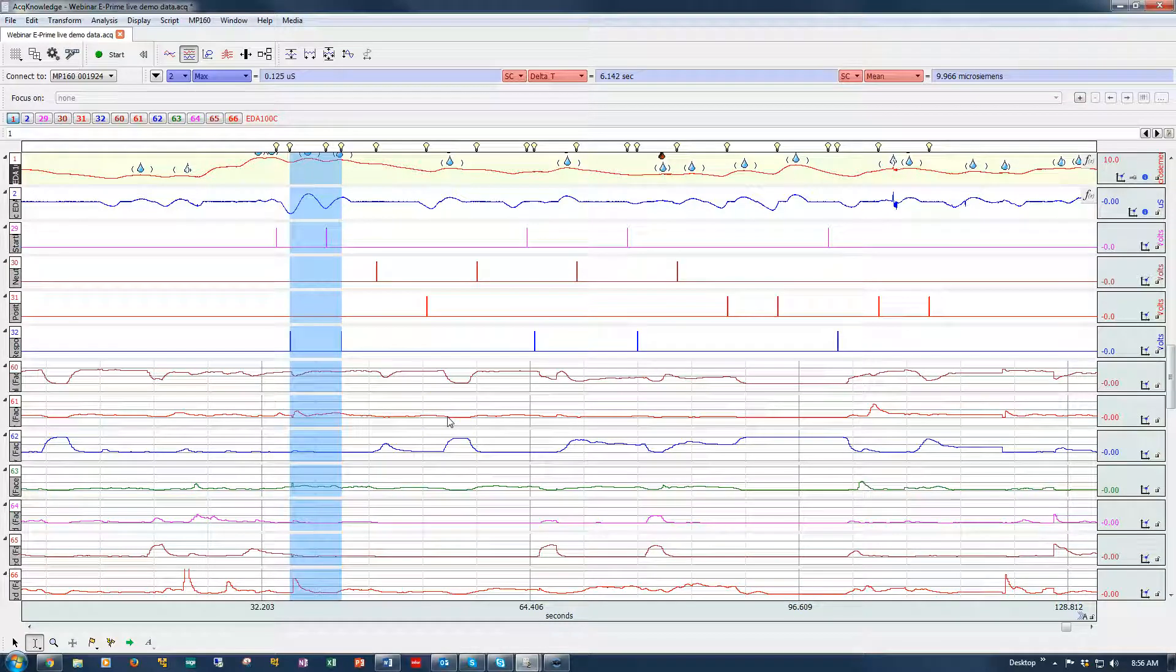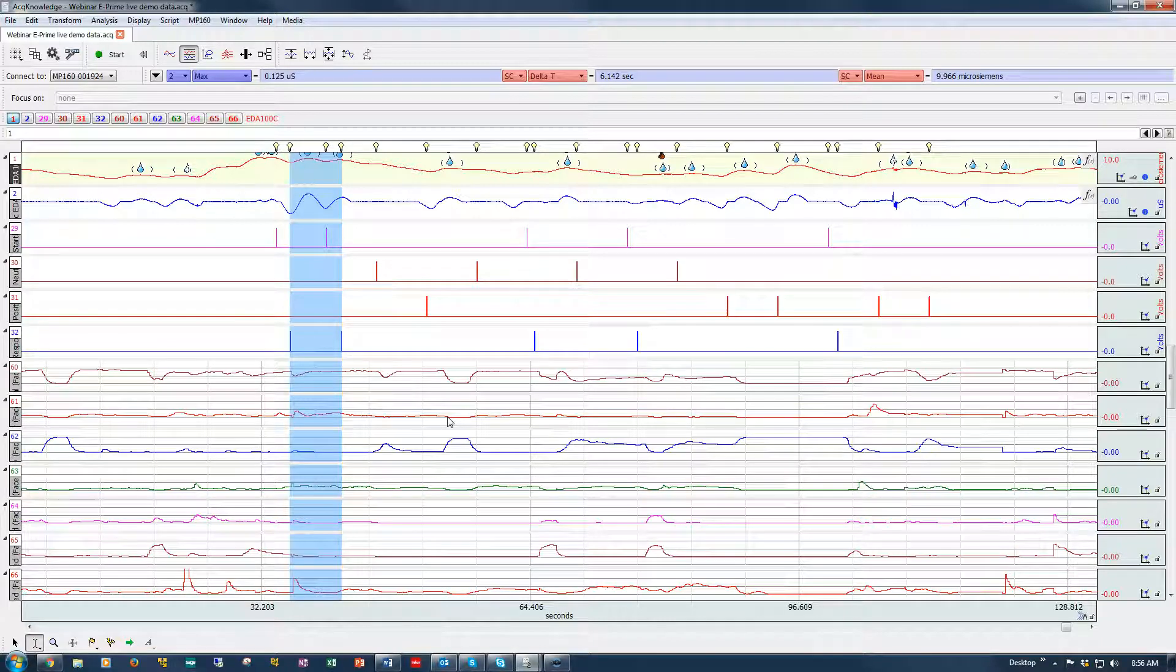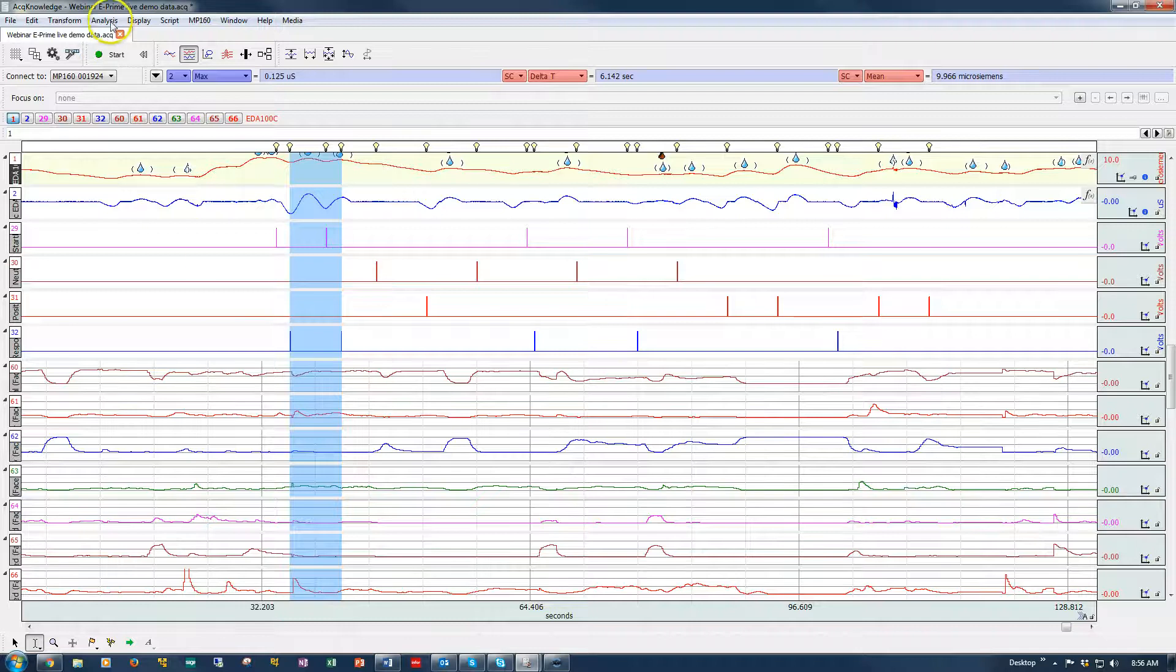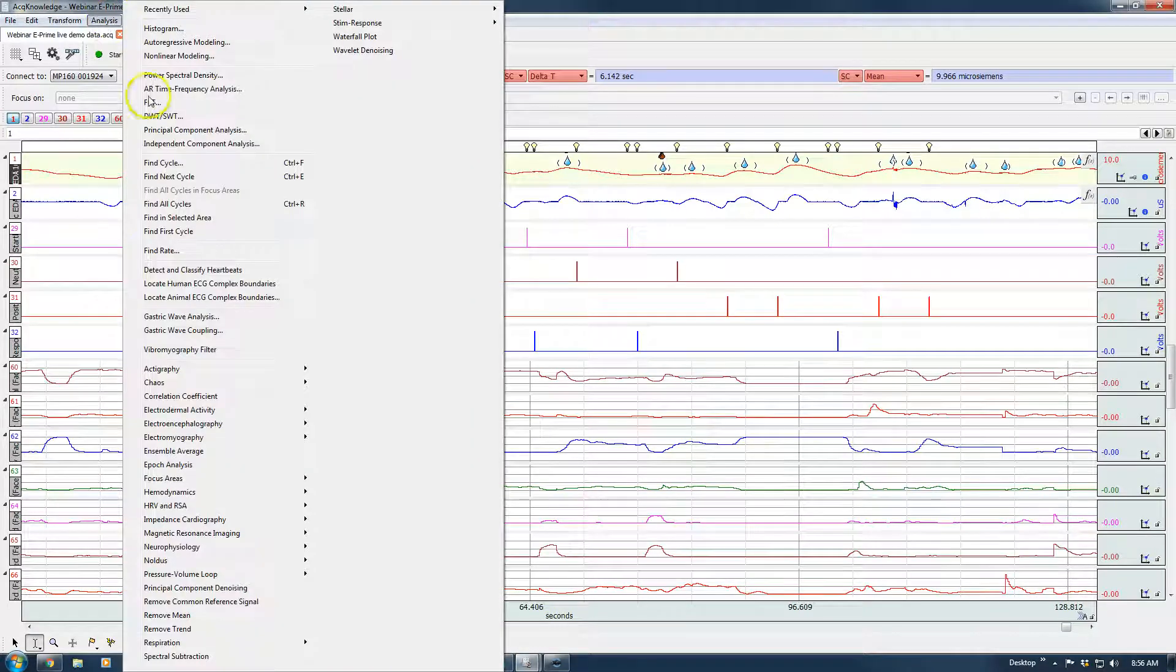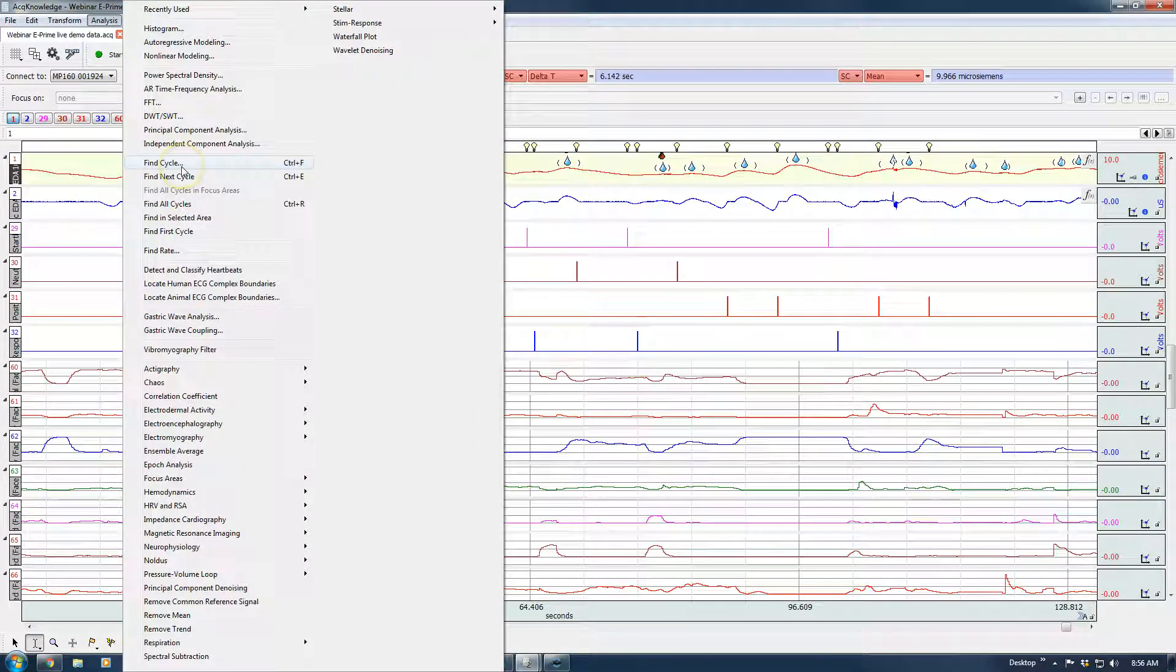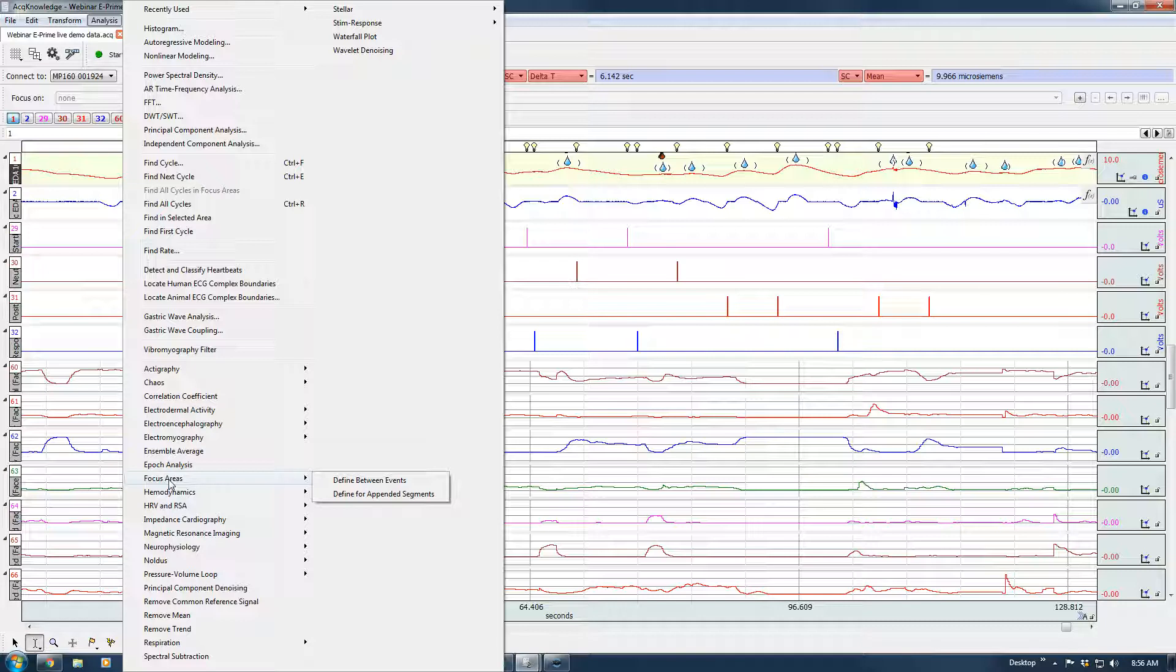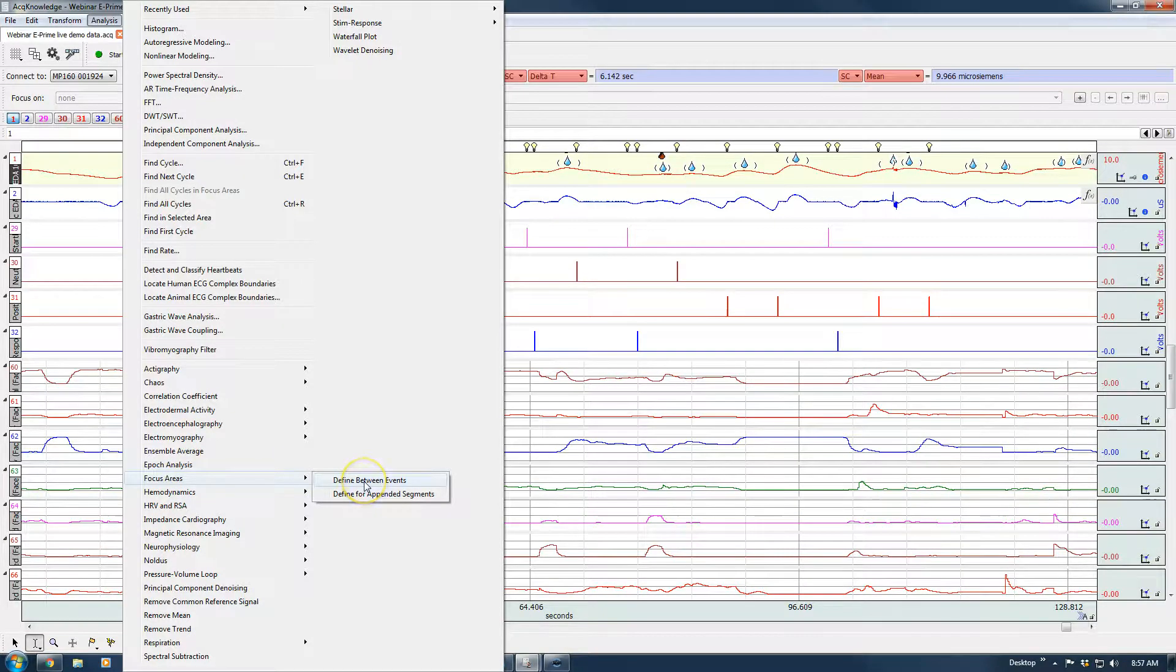In this screencast we're going to look at creating focus areas automatically around digital events. There's a couple of ways you can do this. One is by using the fine cycle detector and there is a screencast that shows you how to use this. But there's also a very nice tool that's built into the system.